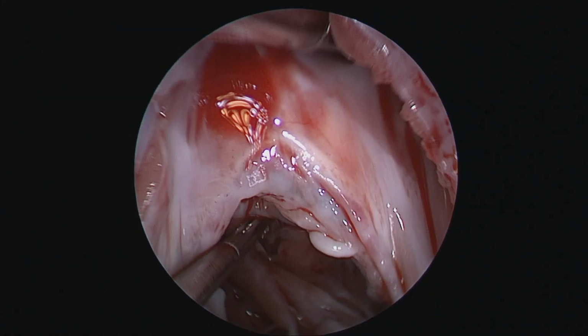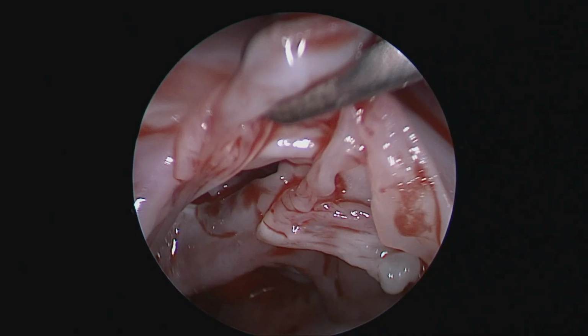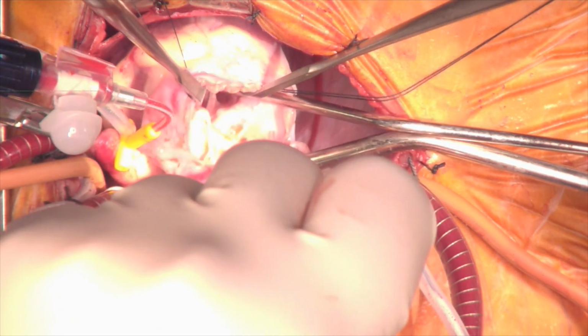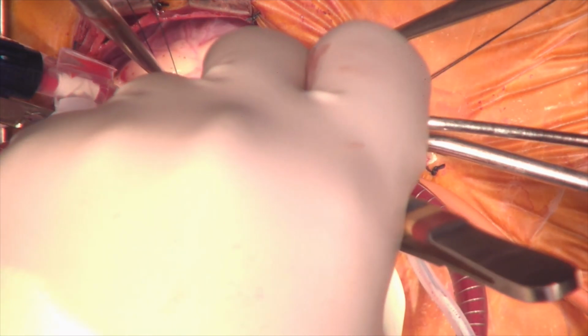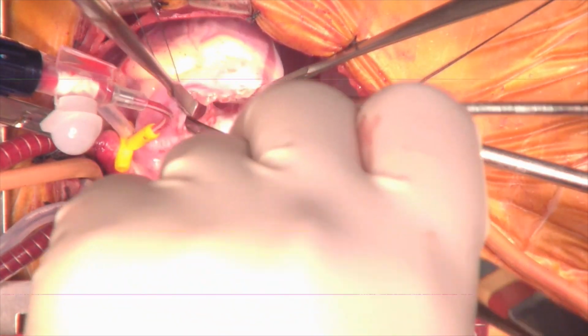This is the view through the right atriotomy. With a pair of forceps grasping the septal leaflet of the tricuspid valve, the perimembranous ventricular septal defect can be seen behind it. The free edge of the septal leaflet is detached. This exposes the ventricular septal defect and allows us to sew in the patch.